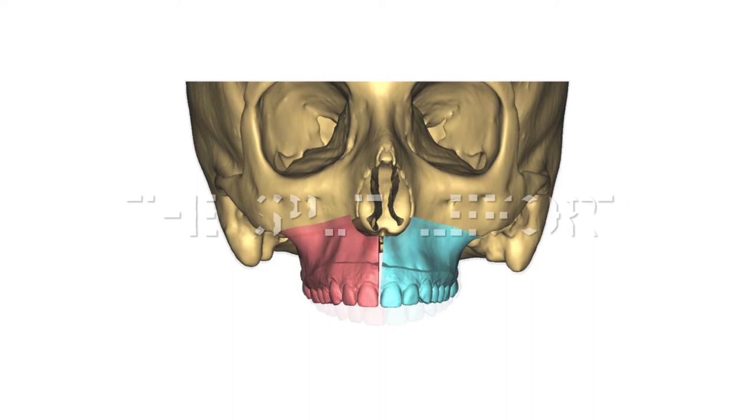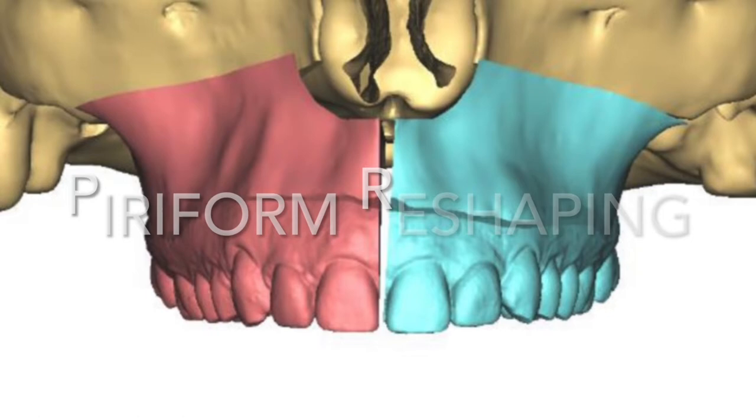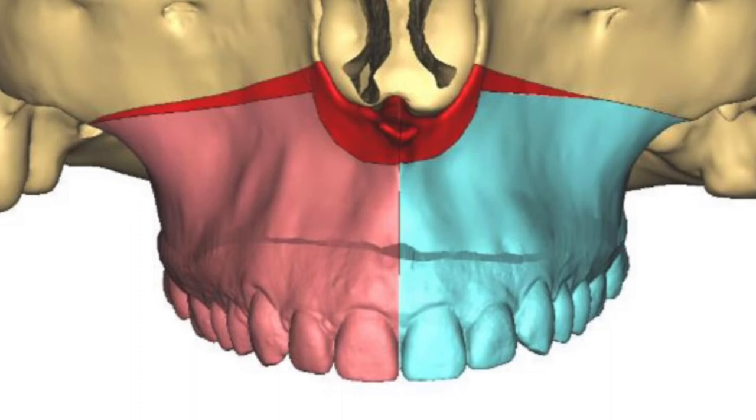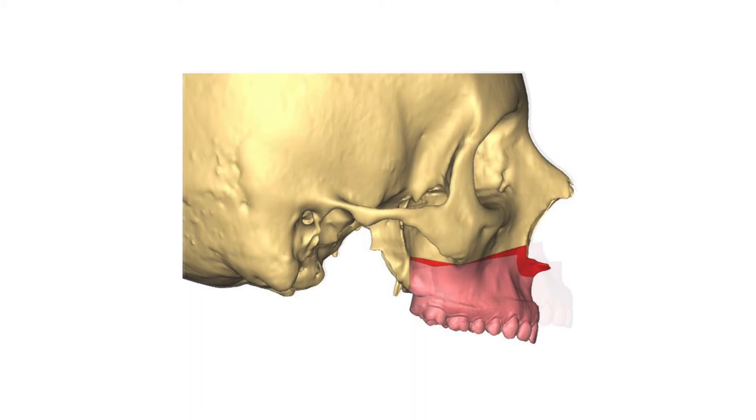The upper jaw is divided into three pieces through a midline split and some piriform remodelling to give better shape to the base of the nose and improve the nasal airway. You can see the nasal mucosa lying above the red, and we're doing a counterclockwise rotation overall, bringing forward that upper jaw around about 12 millimeters.